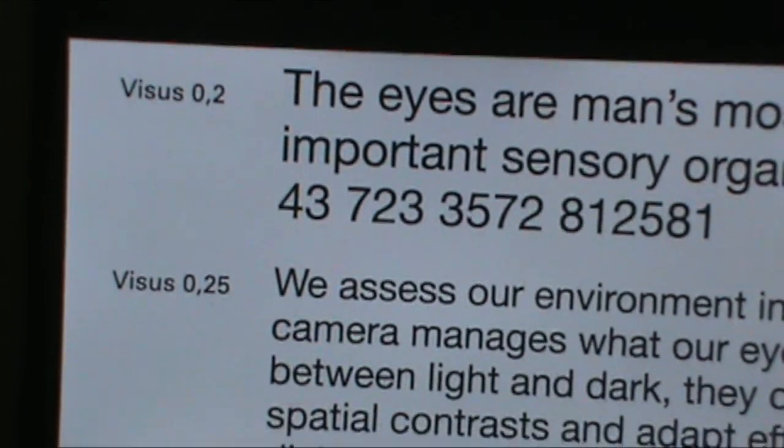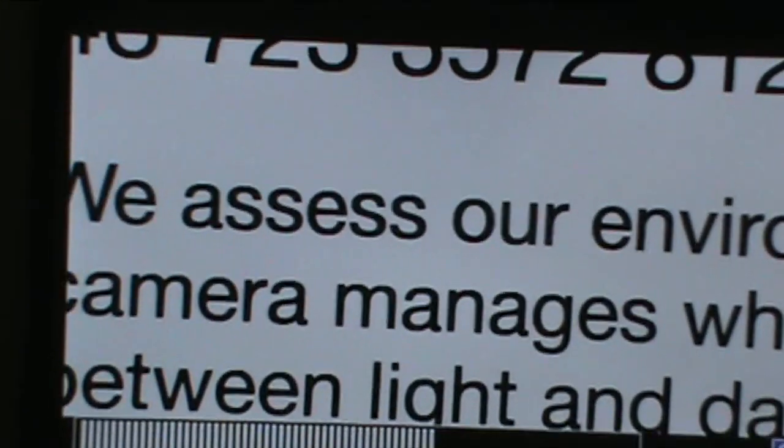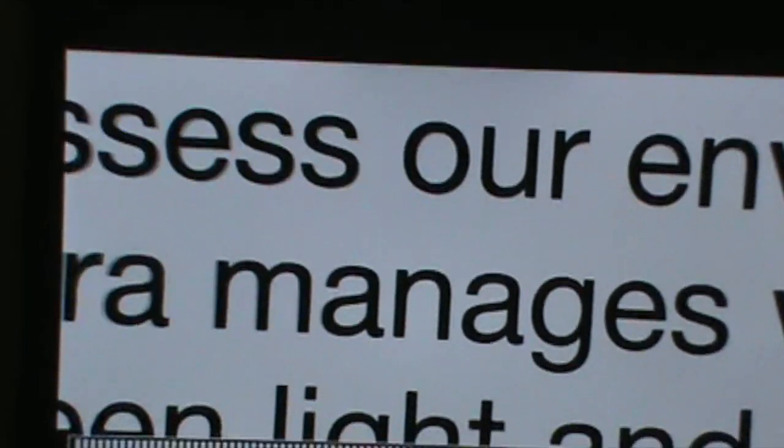And the way to know that, of course, is we're going to go ahead and magnify. And as you can see, when we get more magnification, we get the letter up on screen. We're looking at the A here up on screen. And I'm going to lock the table, because when we are looking at print with this magnification level, we want it to be as steady as possible.